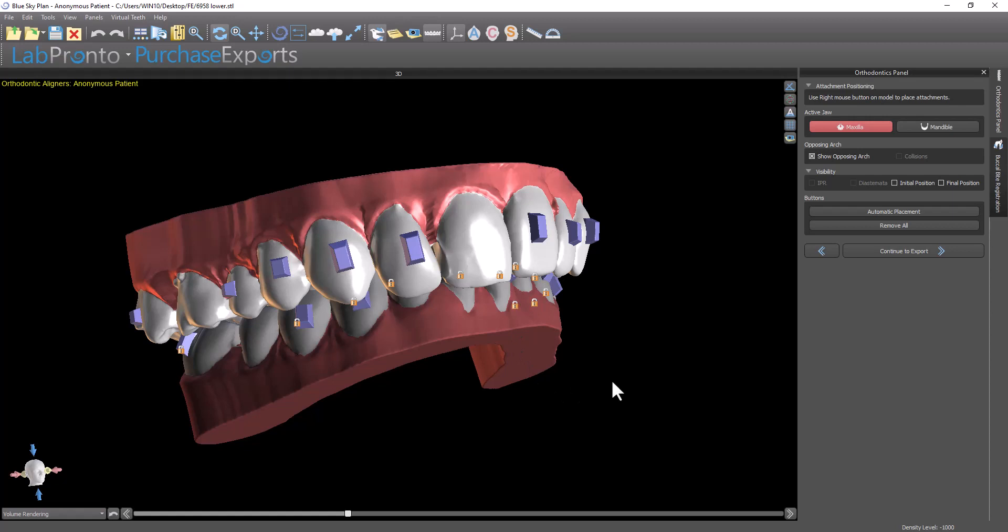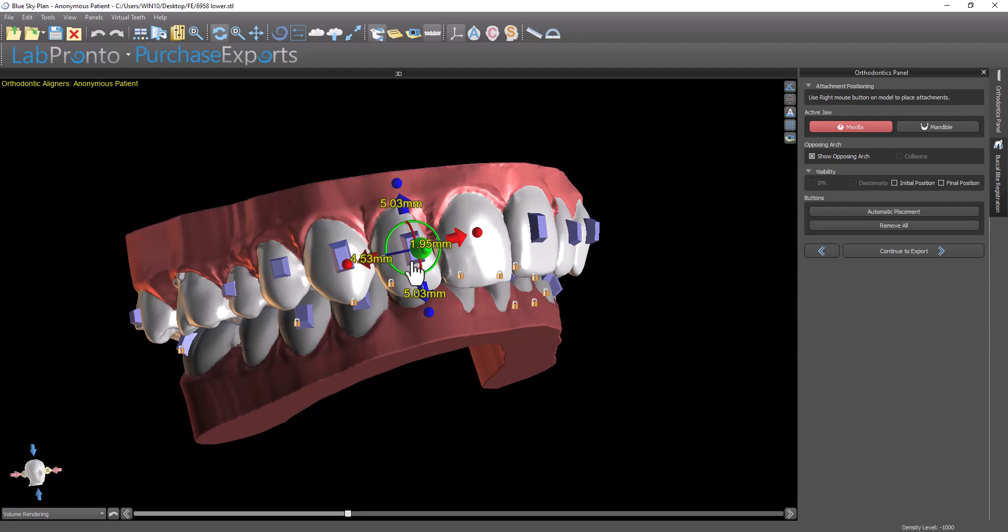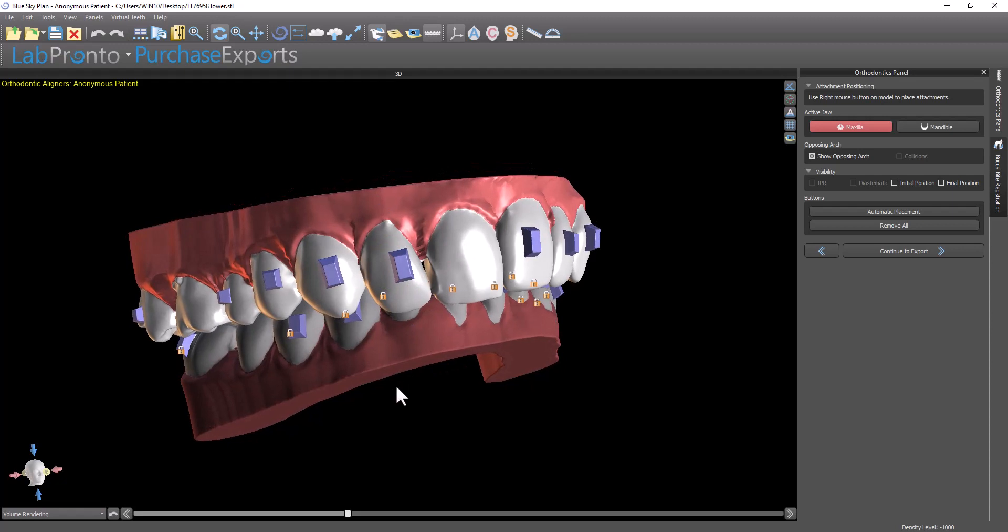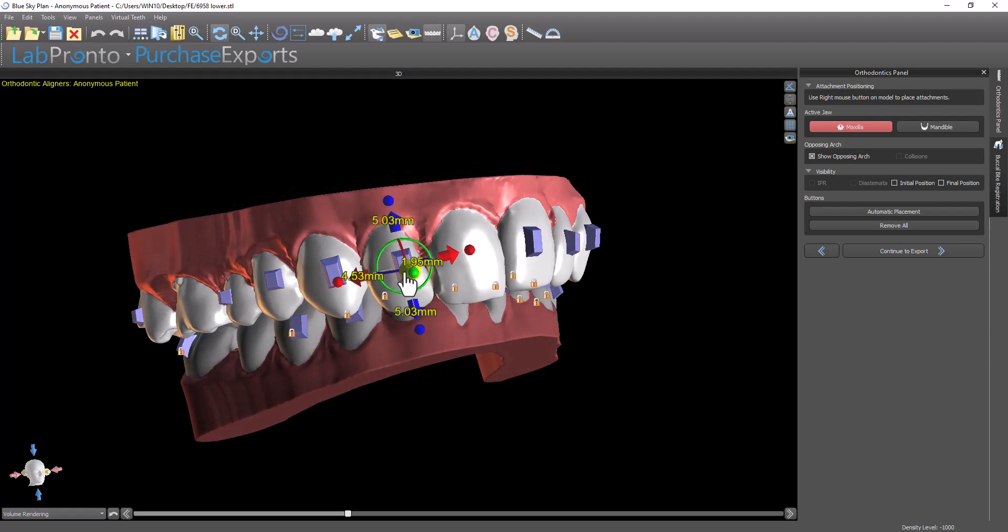If I want to remove particular buttons, all I need to do is make sure the correct jaw is selected and right-click on a button. Here I can move, rotate, or enlarge. I have all the functionality to modify any particular button. I also have the measurements of the button to the edge of the tooth in any direction.